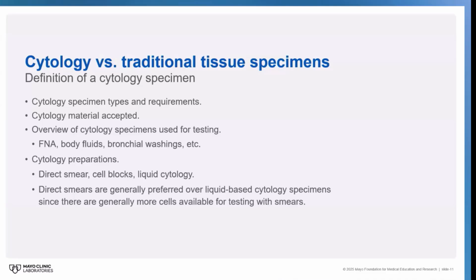We can see them from all over the body, and any body site is usually going to work great for NGS testing as long as we have sufficient material. And next.